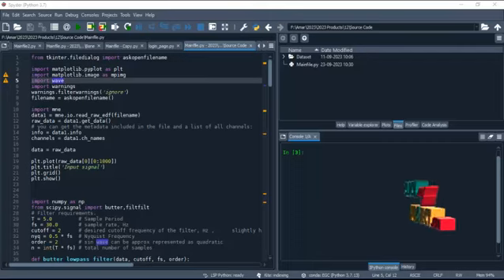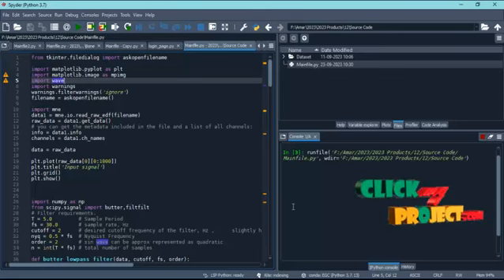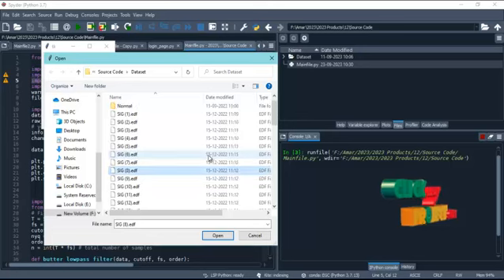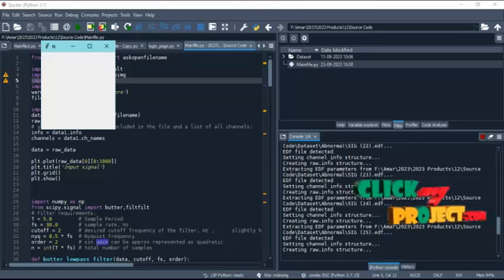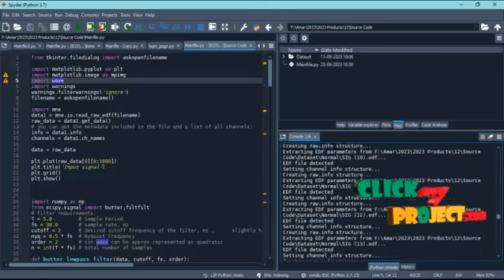At first, open Spyder 3.7 and change the current directory. To execute the file, just open mainfile.py and click the run button. After clicking the run button, we have to open the dataset. After opening the dataset, you can see several signals in it. We have to select any one signal from the dataset. After the selection, the process will be done automatically one by one. Now the process results will be shown in the console one by one. We can see the results here.